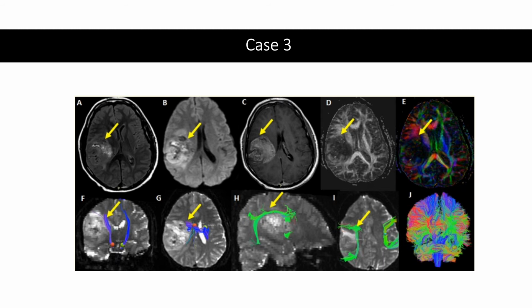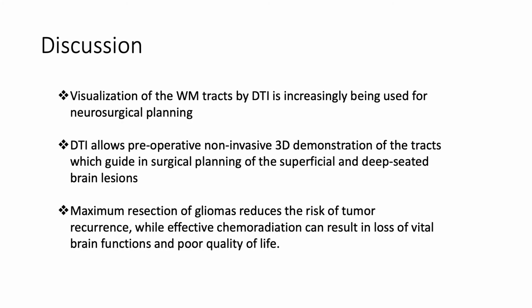3D tractography was initiated from the brainstem for CST. The right CST passing through the periphery of the lesion was compressed and deviated anteromedially by the lesion.